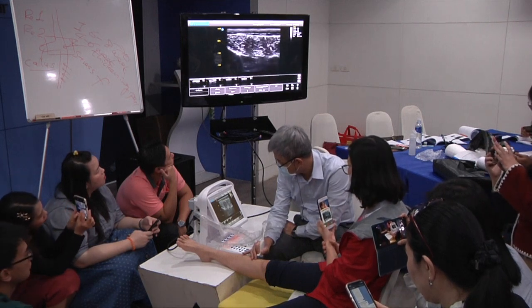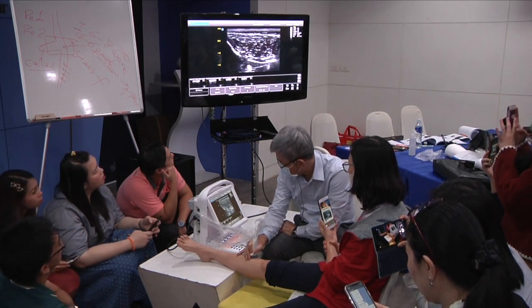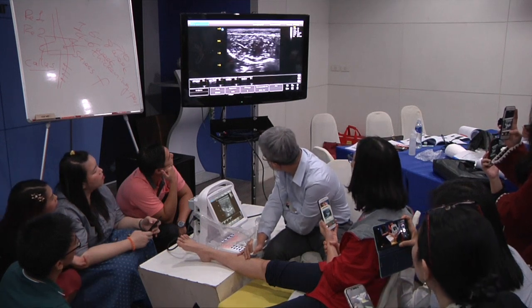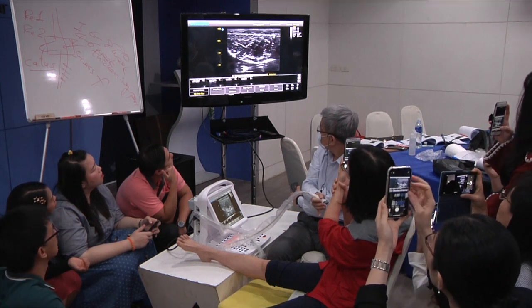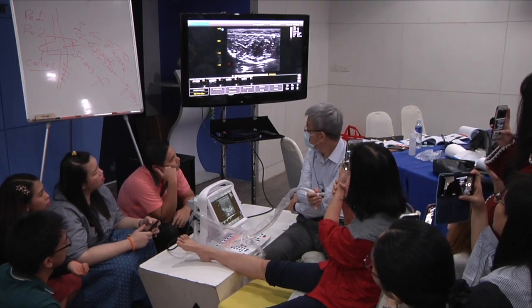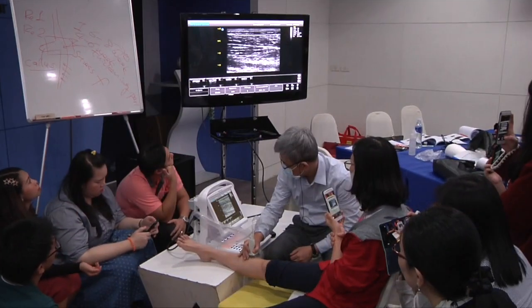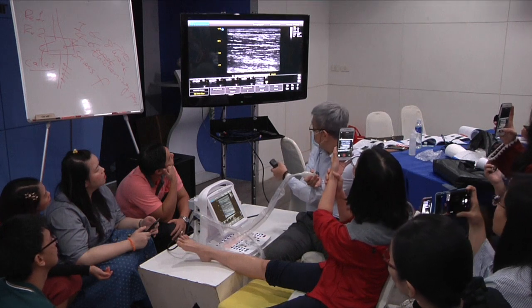When we get close to the border between the superficial layer and the deep layer, you check the bipennation angle structure here, not above. Above this level, you cannot find the bipennation structures. Use the skill you learned, and use the rotation skill for the bipennation.